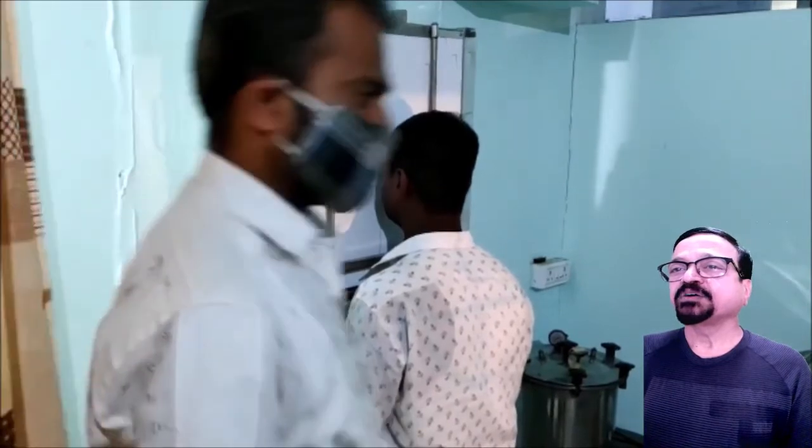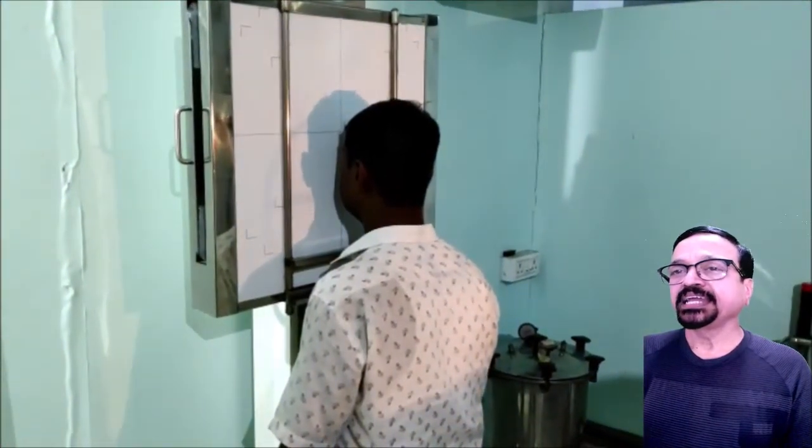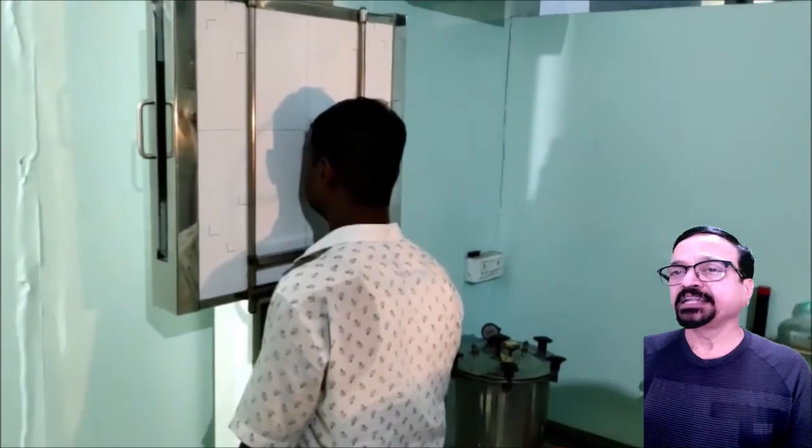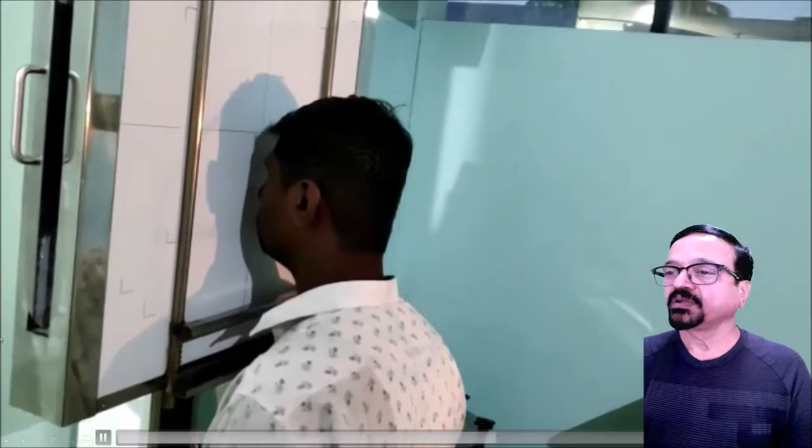You mark right side or left side depending on the side you want. And now this will be a PA for the mandible. Look at the center, it is at the mandible. Proper instructions are given to the patient. The patient should not move.